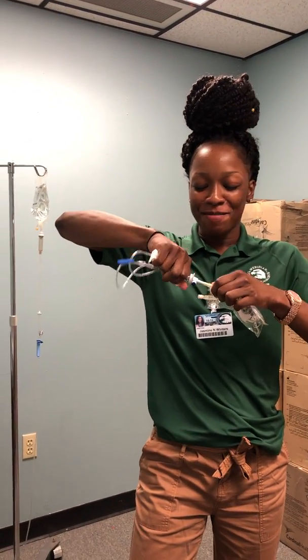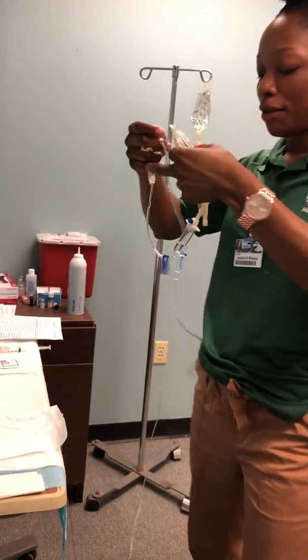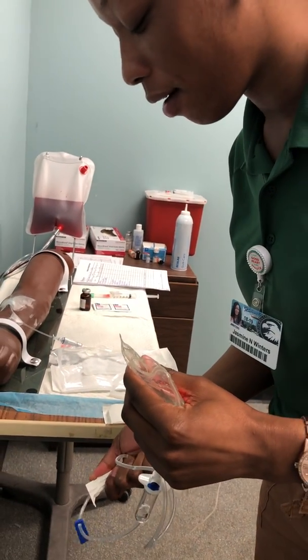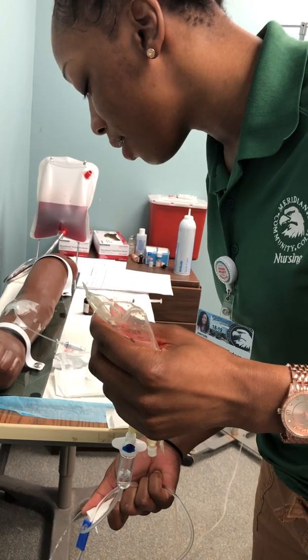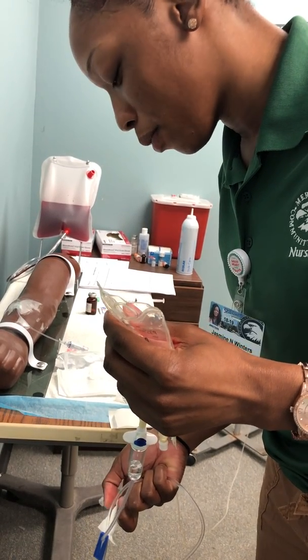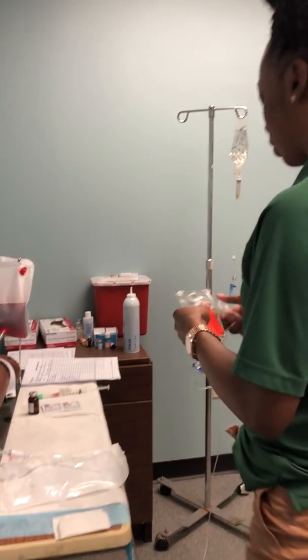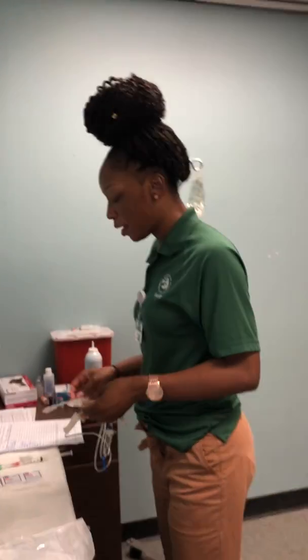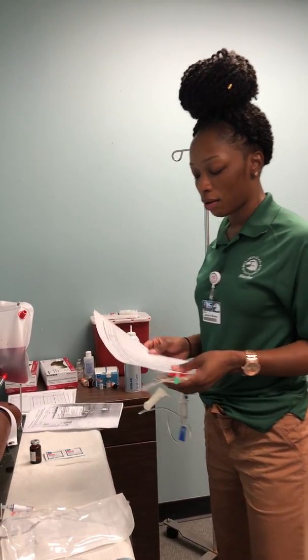Then I would spike my bag and prime my tubing, being sure to get all of the air out of the tube. Okay. Now that I have my medications prepared, I would then take my medications and my MAR to my patient's room.